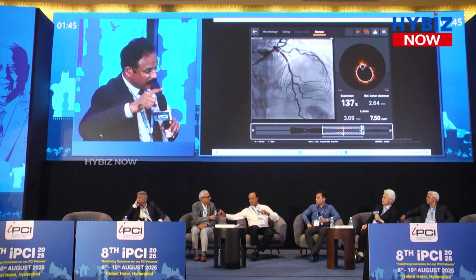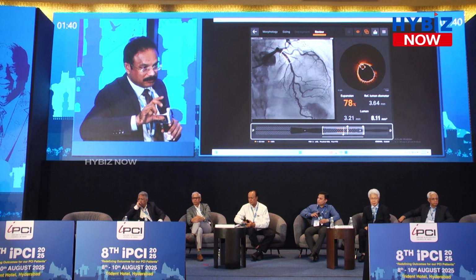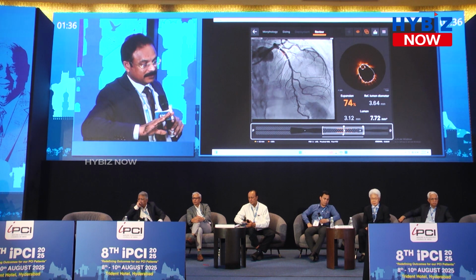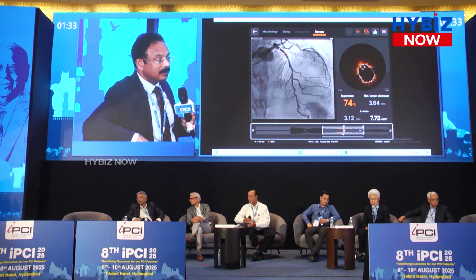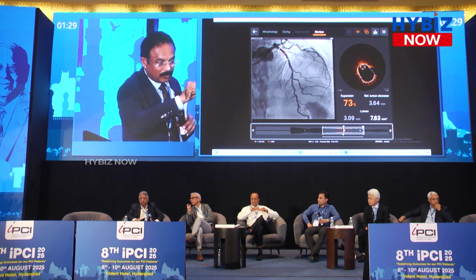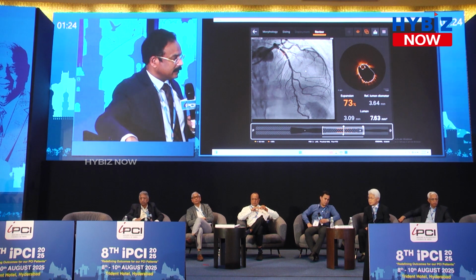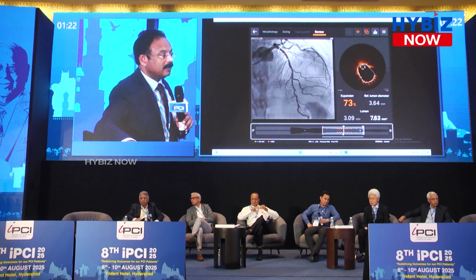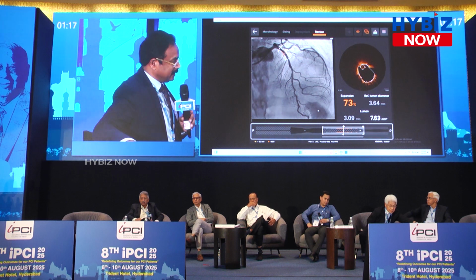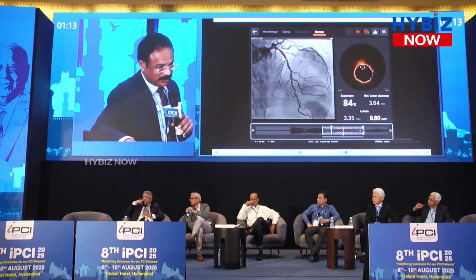And if you see here, there is an interesting thing. Look, they were discussing what the absolute MSA is. Here the absolute MSA at the tightest point, with 74% expansion, is 7.72. That means the vessel is very big. But at the same time, you can see that the orange marking is coming down. Now there is only one particular spot where you have the orange margin with a 73% under expansion. So here I decided on going with a 3.75 millimeter balloon and expanding it again. Whether it is right or wrong, it's subject to your discussion.